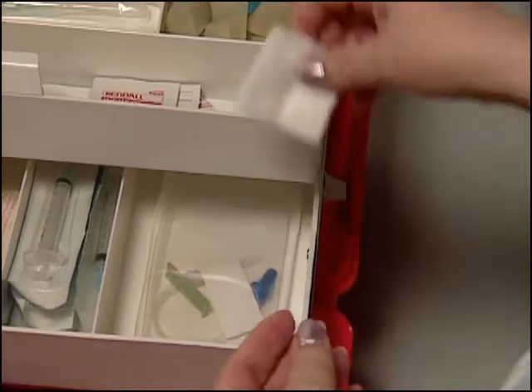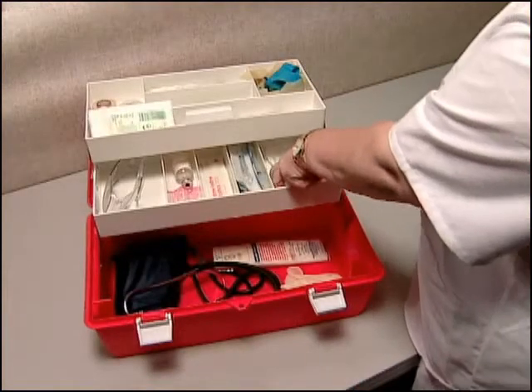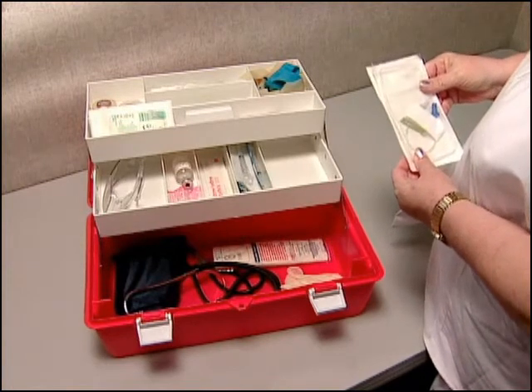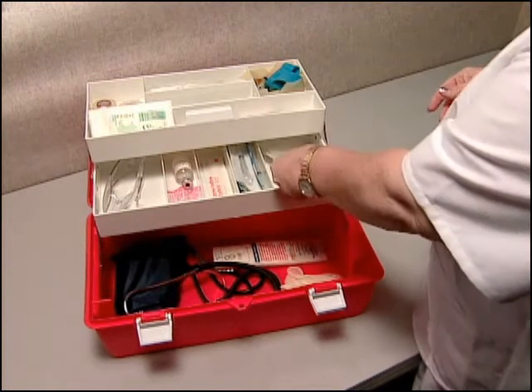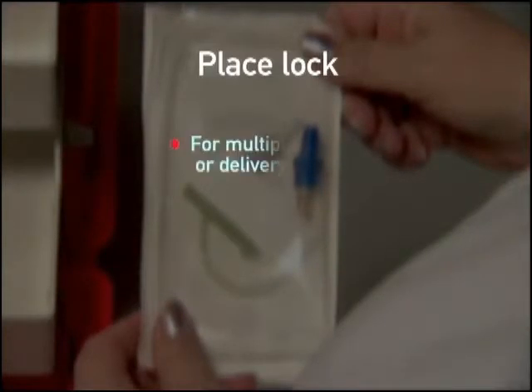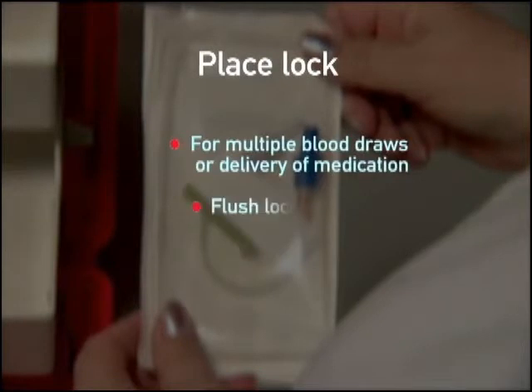When assessing the need for catheter insertion, you will need to decide whether to place a lock or start fluid. If the catheter is being placed for multiple blood draws or delivery of medication, then a lock, a small plug with a reusable rubber stopper, is placed into the hub of the catheter. Before use, the lock must be flushed with saline to prevent clotting.